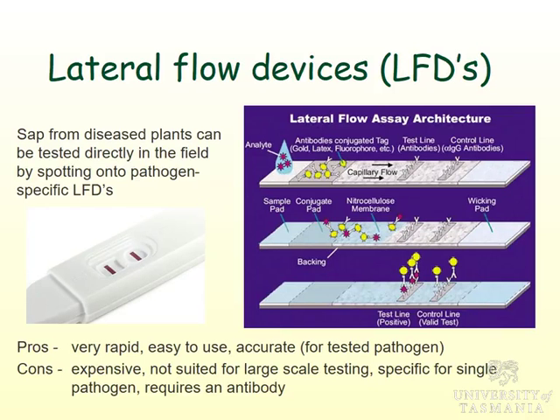It is, however, quite expensive. So you wouldn't be using this for large-scale surveys. Each one of these is probably a couple of bucks, or even more. So you're not going to be testing thousands of plant samples by this manner. It's also not good for large-scale testing, because you really don't want 10,000 of these things laid out and grinding them up and spotting them all on. There's more efficient systems for that.